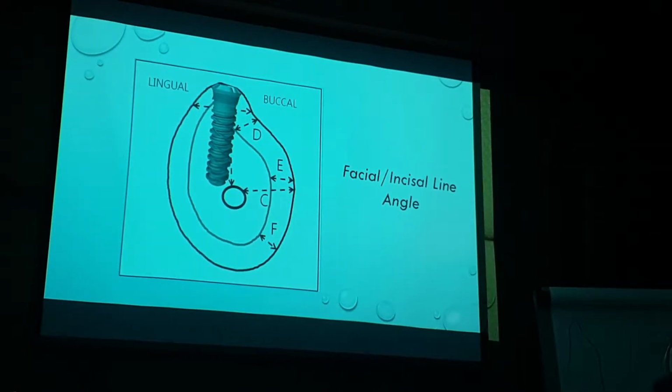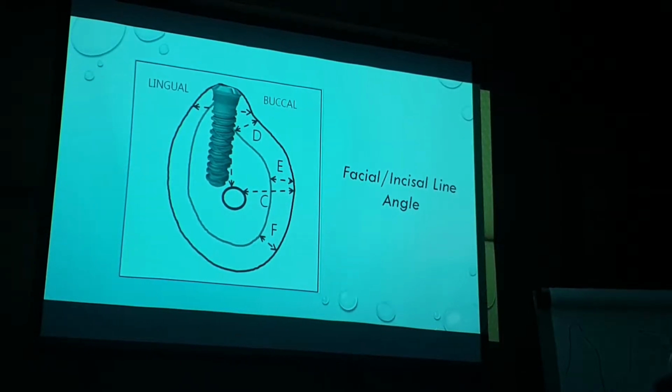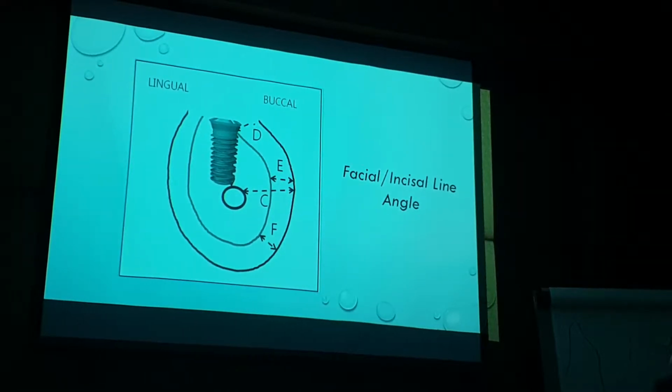But suppose this is a molar position, and a small diameter implant is not going to be sufficient for that. What's the next thing we do? We do a ridge plasty, right? We cut down on the top of the ridge. Yes. Now we place a shorter, wider implant, right? We do it every day. That's what we do. But that's fine in the non-aesthetic zone. You can't do that in the premax zone.